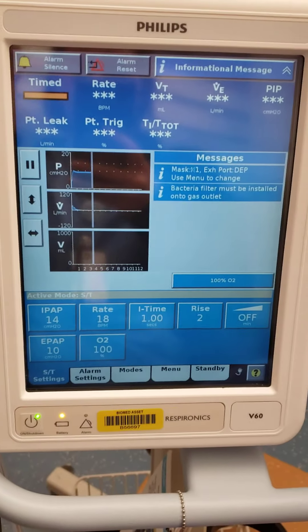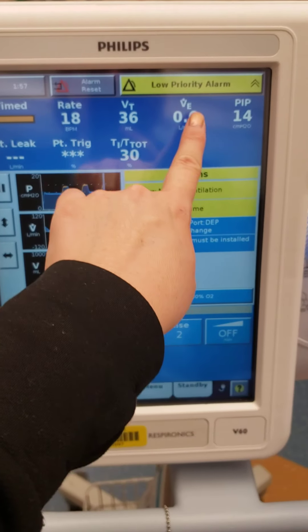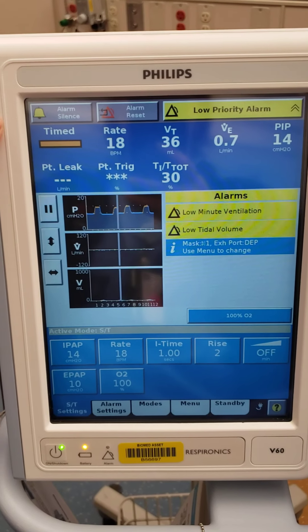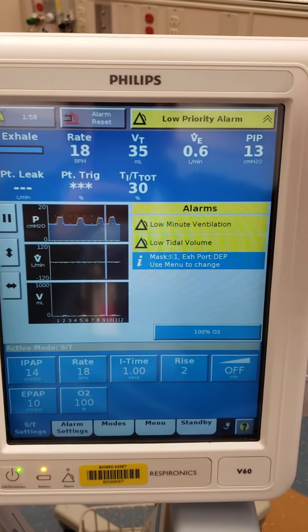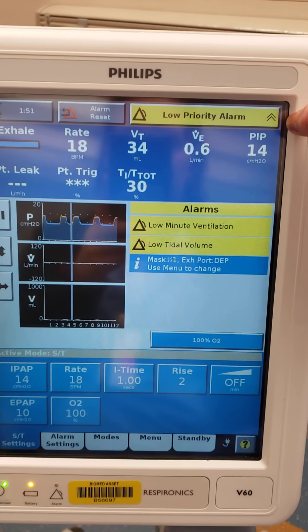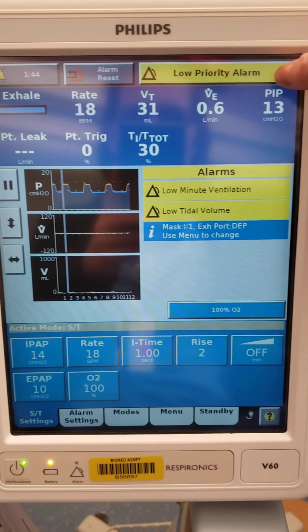So this is kind of the main screen. Most important: the silence button. Alarm reset just clears all of your alarms and turns the silence off. And then this tells you the severity of the alarm — if it's just like maybe your patient was breathing a little bit fast or a little bit slow. And that's another way you can clear it.